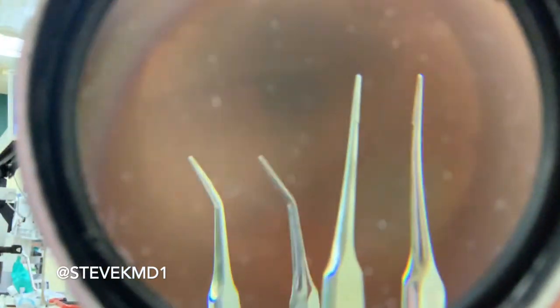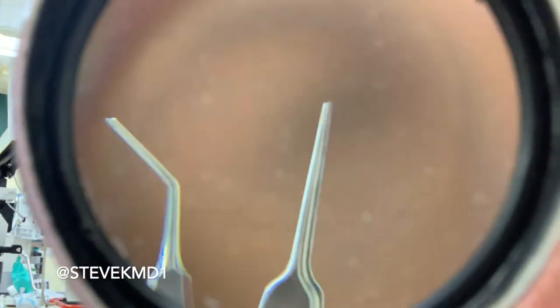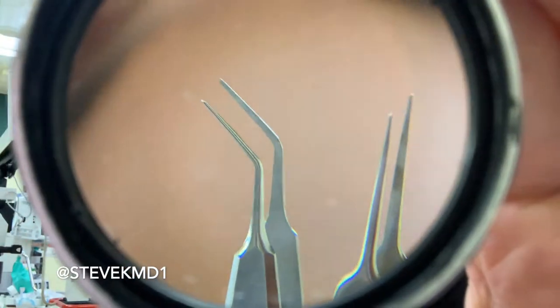Other instruments on the tray are tiers. We don't use these a lot in cataract surgery, but there are two different instruments — a straight tier and a curved tier, or McPherson as we sometimes call it. They're flat on the ends and we use them for tying stitches. We don't use them a lot because we don't use a lot of sutures in cataract surgery.